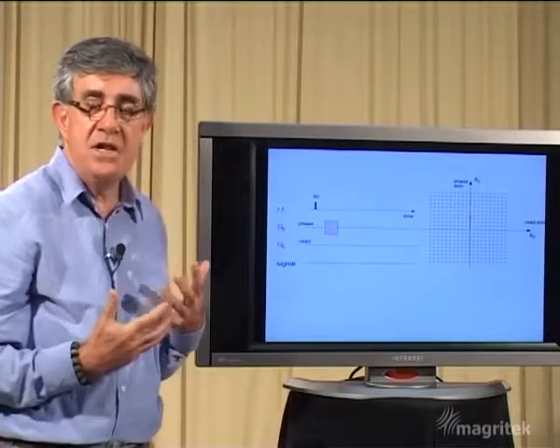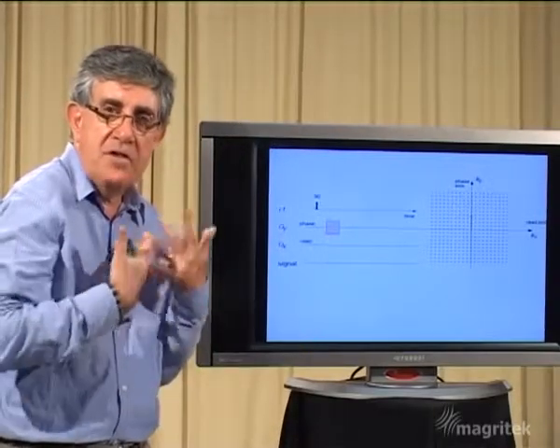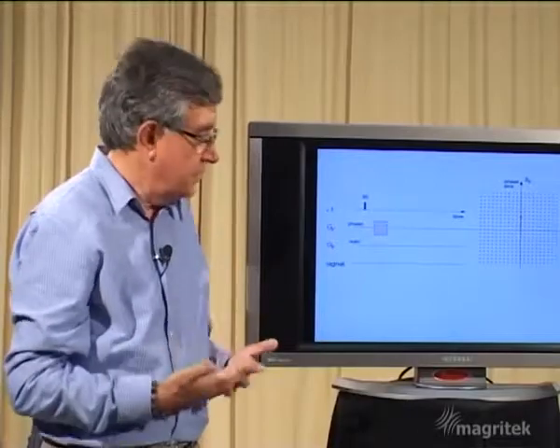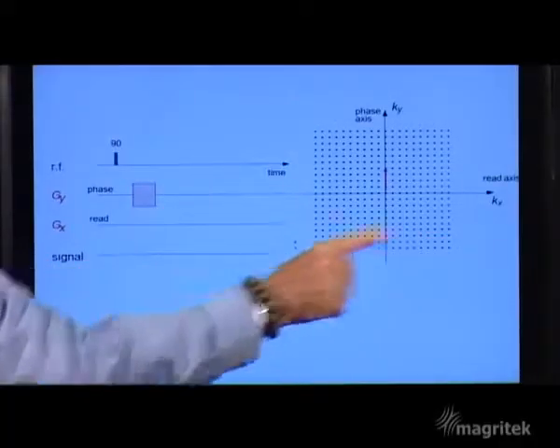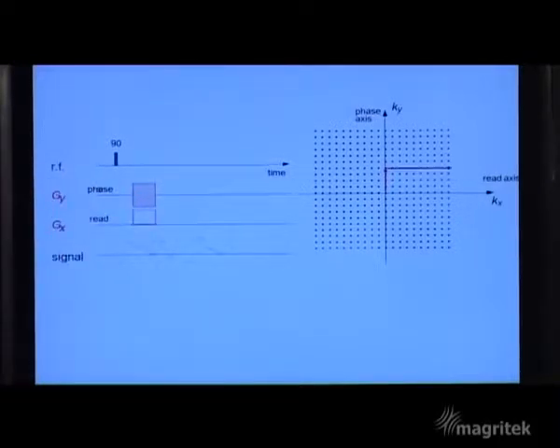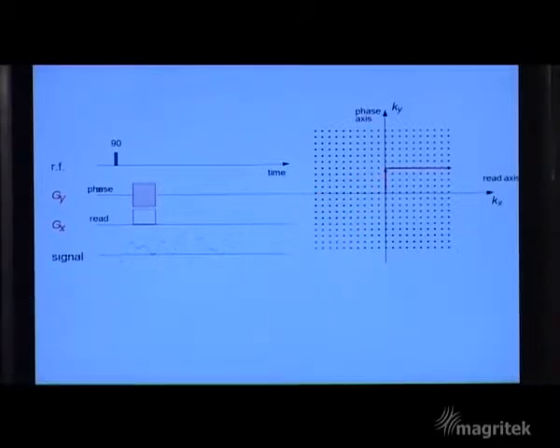What we're going to do now is to carry out a traverse through K-space. We're going to look at a way of describing the history of what the spins do with time under the application of magnetic field gradient pulses. Here I've labelled a y-axis and an x-axis, and we're going to start off with applying a magnetic field gradient as a pulse along the y-axis. Here we see this pulse here. What has it done? It's lifted us up to some particular position along the y-axis in K-space.